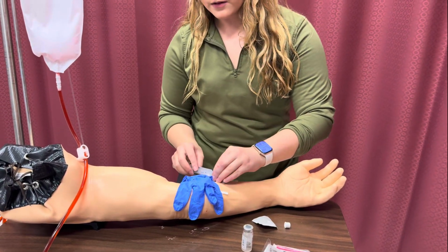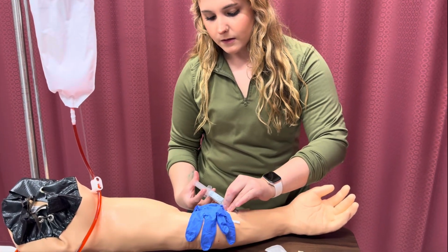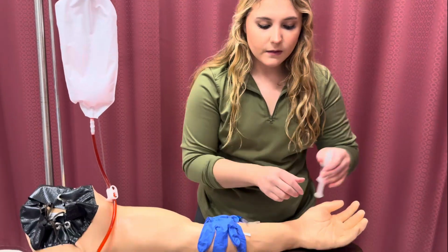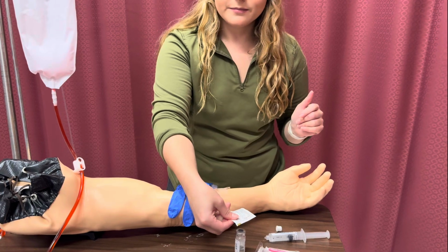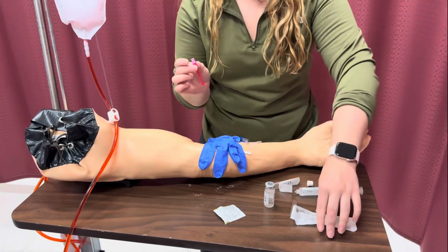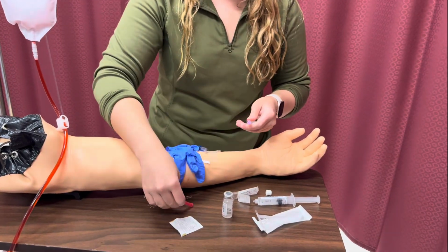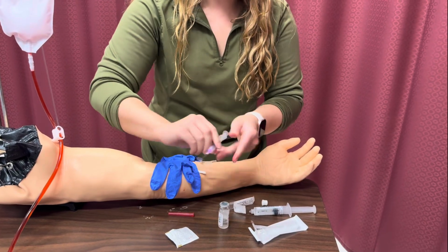I would flush for a minute. Okay. Make sure that I'm getting drawback as well, and that it's not burning or hurting the patient in any way. After that, I would clean off my antibiotic. Apply my blunt needle. Okay. Pull back. We'll do about 1 milliliter.